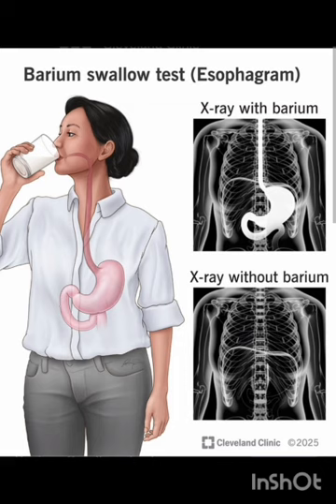Then, very important, aftercare. The patient is advised to increase the fluid intake to avoid constipation. Then inform the patient that the feces will be whitish for 2 days. Do not panic about this. The patient will be allowed to leave the examination room after completion of the study.